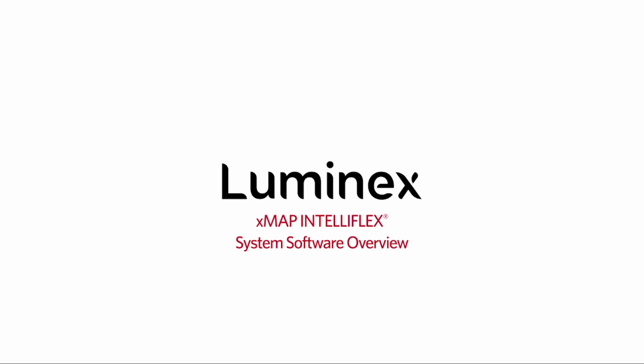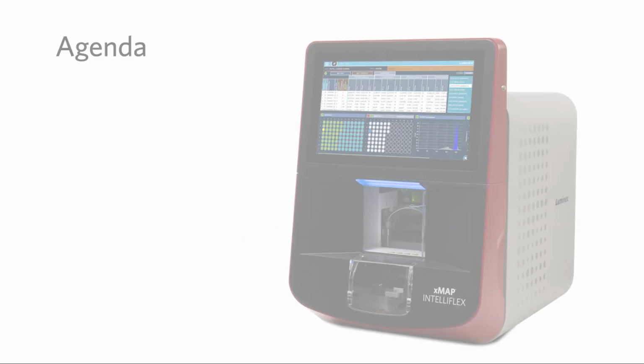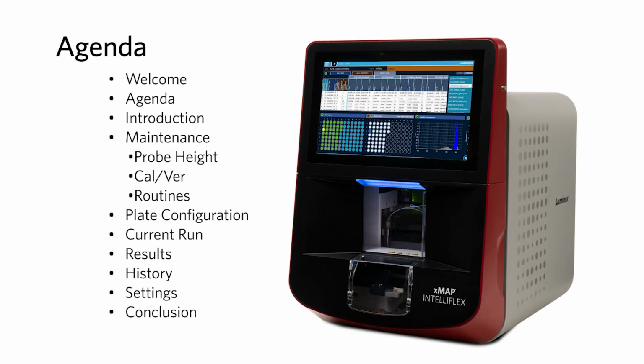Welcome to the xMAP INTELLIFLEX System Software Overview Training. In this course, we will introduce the xMAP INTELLIFLEX system software. Then we'll take a closer look at each page of the software, including the maintenance probe height, CalVer, routines, plate configuration, current run, results, history, and settings pages. Let's begin with a brief overview of the software interface.